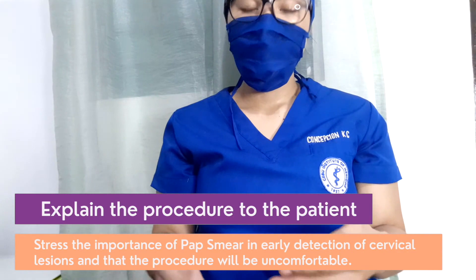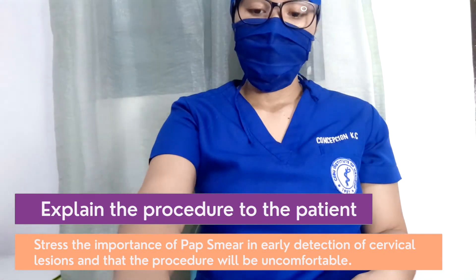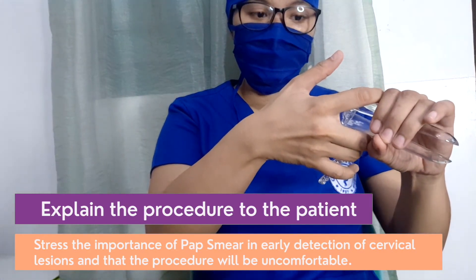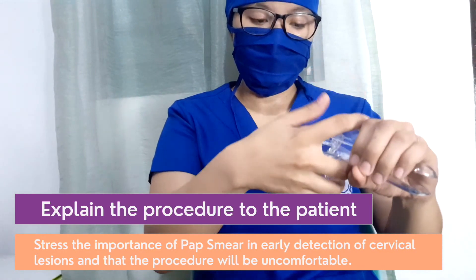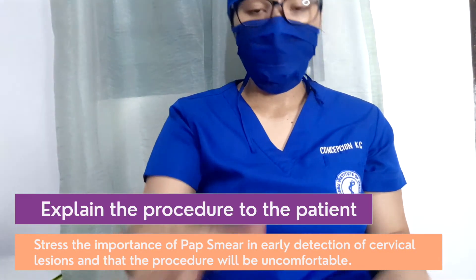Maayong adlaw, ma'am. Ako si Casey Concepcion. Ang atumbuhatong karong adlaw ay kinatawag na PAP smear. Kini ang pagsample sa inong cervix aaron makaskrinta sa cervical cancer. Ipahigati ka, ma'am, unya. Narakoy isulod sa inong puwerta aaron ma-examine na ito sa sulod o makakuha og sample. Medyo uncomfortable siya, ma'am, pero dalira siya mahuman. Musugot ka ni, ma'am?